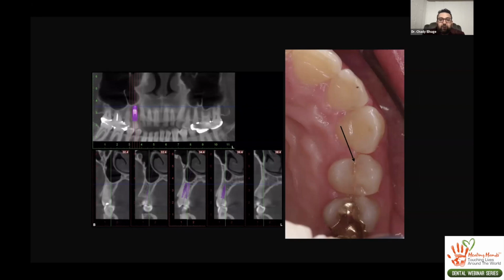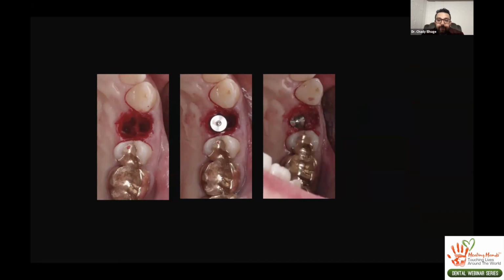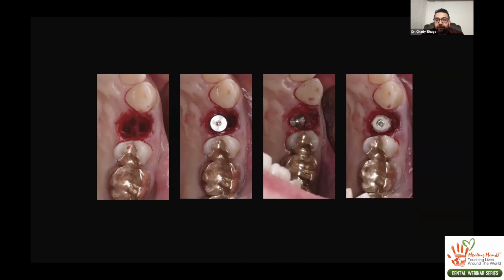Tooth is removed. The implant is placed. Implant is always placed towards the palatal just because you don't want to be too close to your buccal bone, because you get a little bit of suck back and resorption of that bone over time. Particulate cadaver bone or graft bone is placed in there. And then that is our temporary cylinder that the restoration is made to fit on.